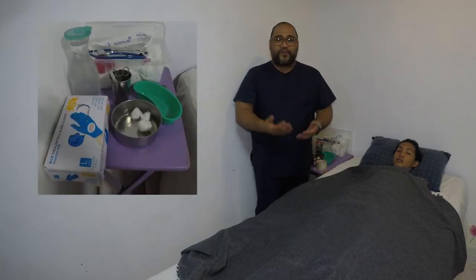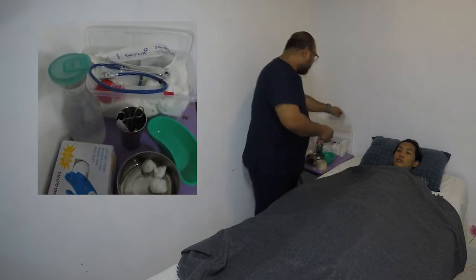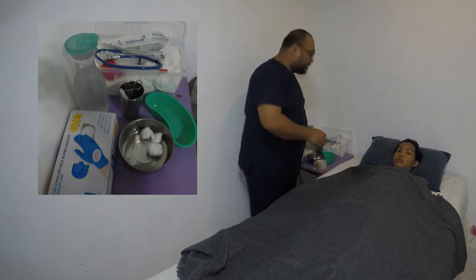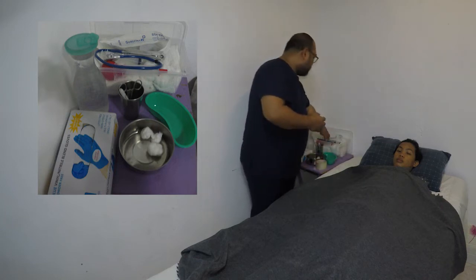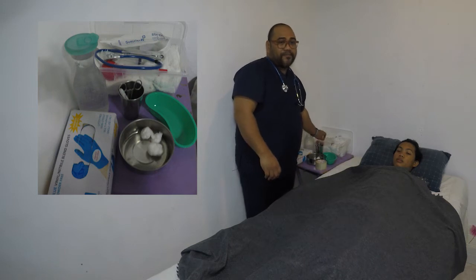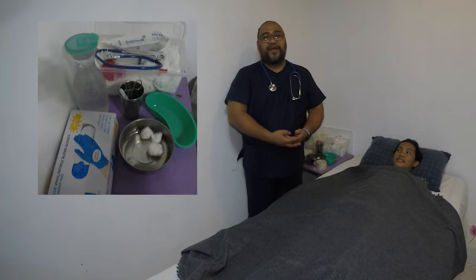Materials needed are the following: the nasogastric tube in appropriate size, this one. We also have the syringe, the lubricant, cotton balls here, kidney tray, adhesive tape, stethoscope, the clamp, marker pen, steel tray, and disposable gloves if available.